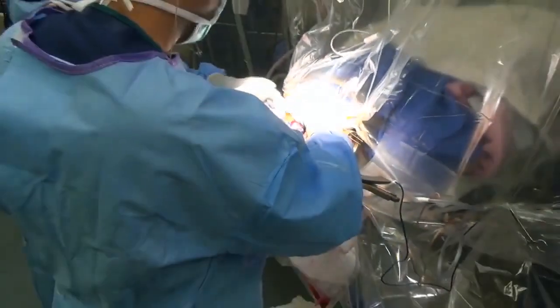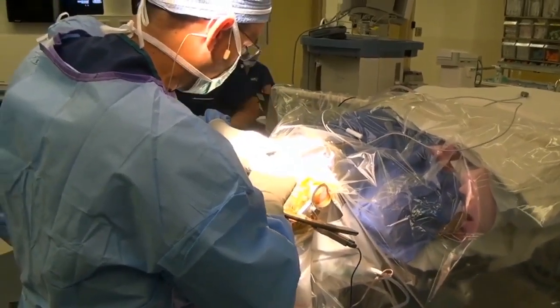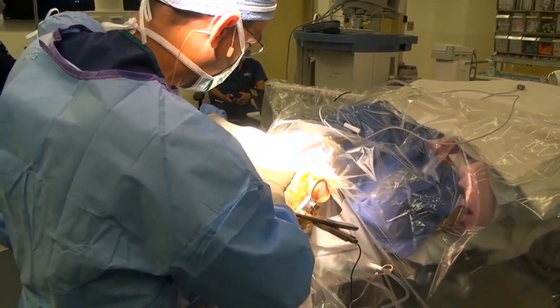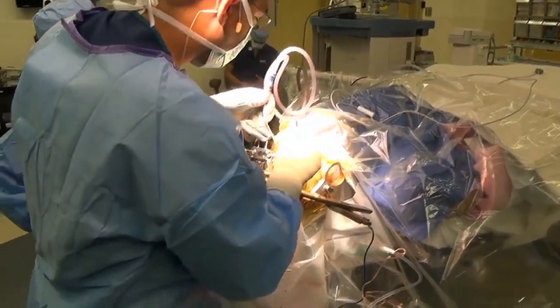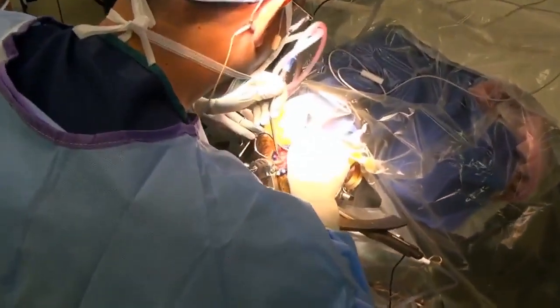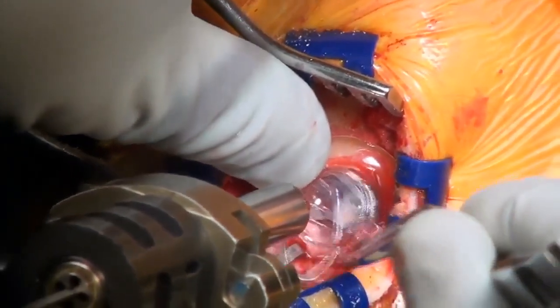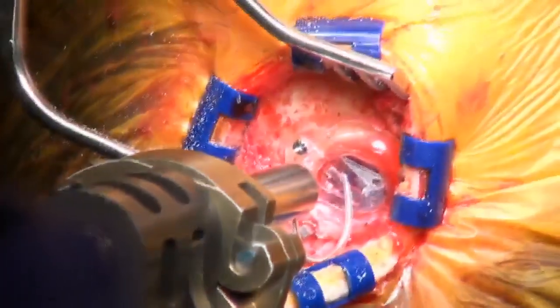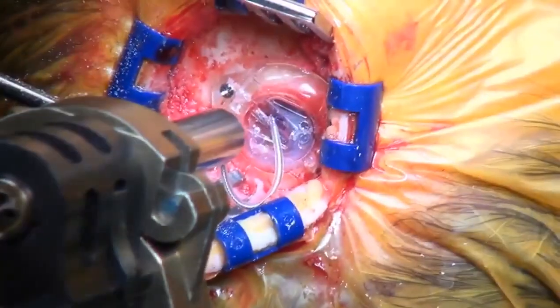Michelle, go ahead and hold this down a little bit. If you push this down right there, push it down like that. Suction.